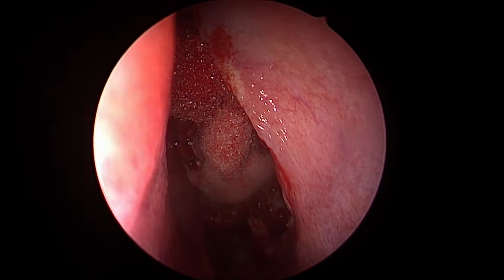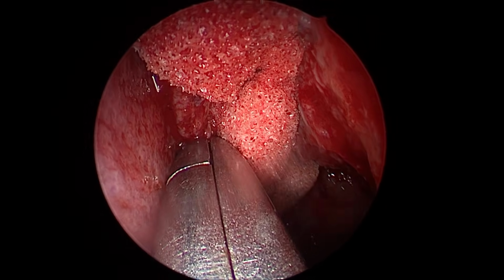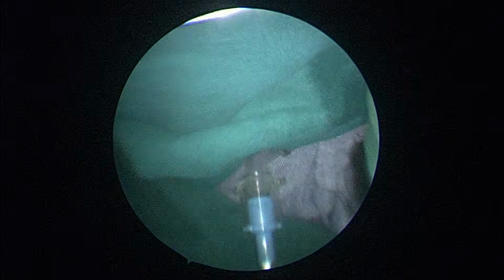See, after every step, decongest the mucosa for better visualization. Okay? Yes, sir. This is not a wastage of time, this is saving time. Now changing to the 70 degree. With the 70 degree, you have seen the angle of the frontal sinus on CT scan, how anteriorly and superiorly placed.